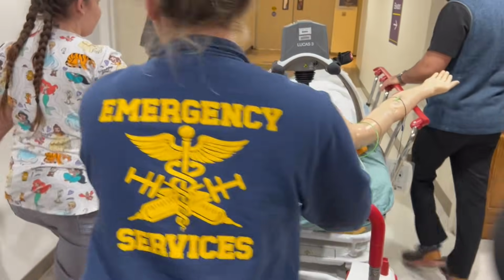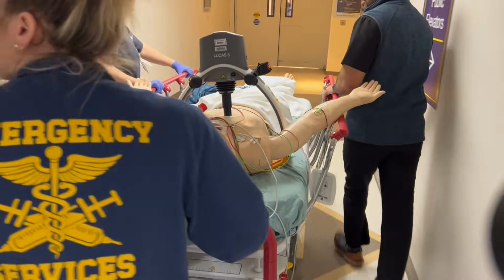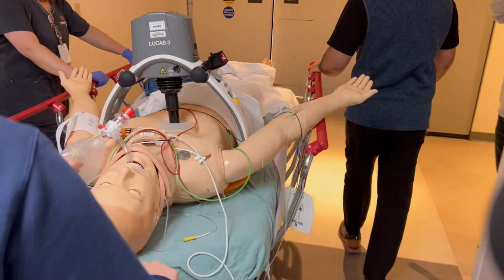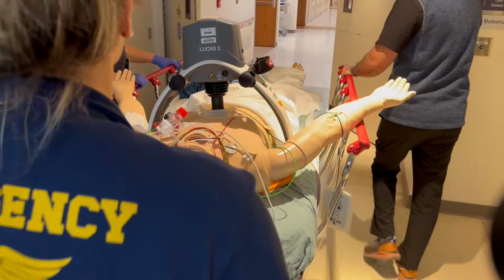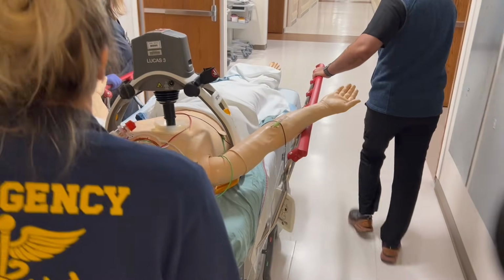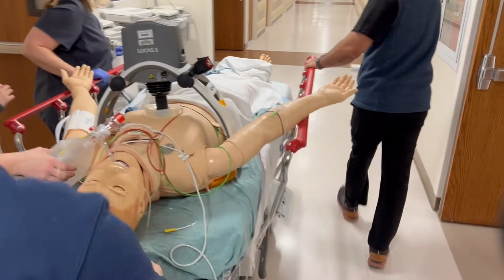We'll continue to keep it on here. Is it helpful that people are serious? No, ma'am, it's not. I can drive this bed. It's easier for one person.